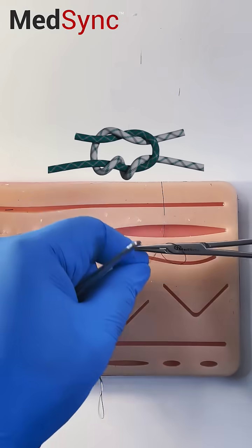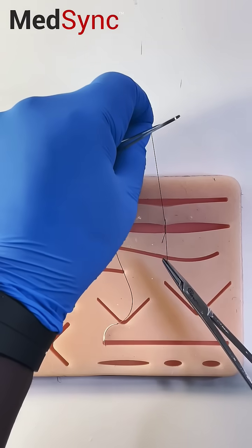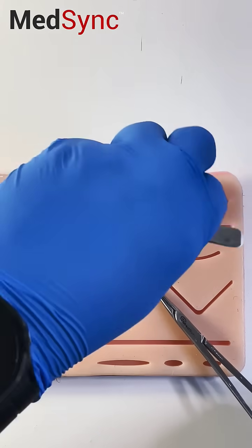Do your surgeon's knot, tighten it. This is the trick.